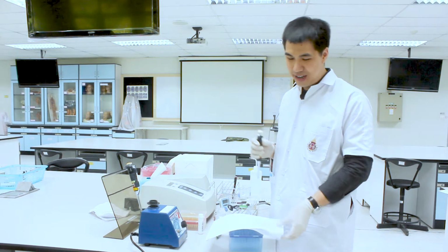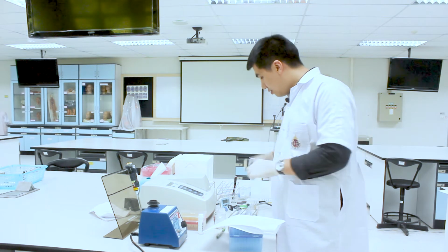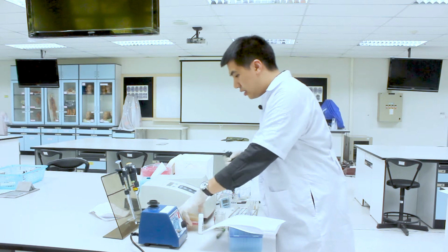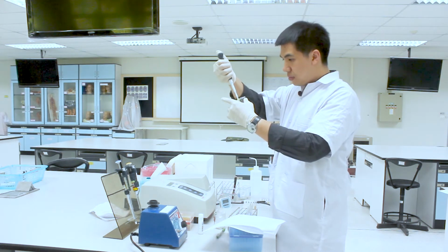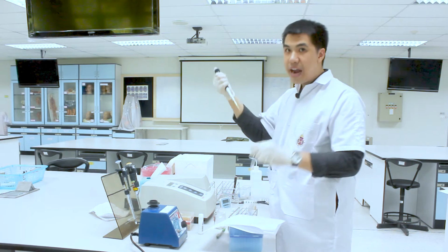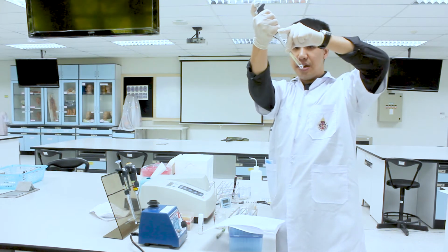Now you just pipette 10 microliters of each sample into these 6 test tubes. The first one is the blank. For the blank, you just pipette 10 microliters of distilled water. Again, for the small volume, you add it directly into the surface of the reagent.